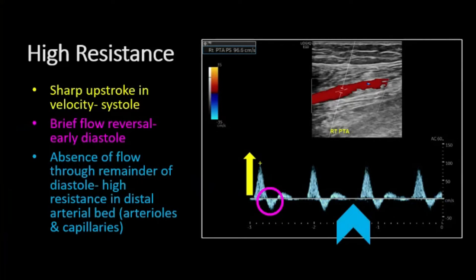Focusing on this high resistance waveform, classically you'll observe a sharp upstroke and velocity with systole, followed by the normal brief flow reversal in early diastole. The high resistance encountered in the distal arterial bed within arterioles and capillaries contributes to the absence of detected signal between waveforms, representing absence of flow.